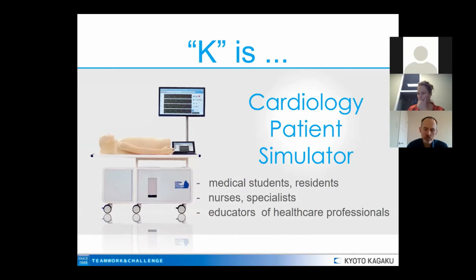education, which are dedicated to research about finding new teaching ways. They also use this model to make their papers, their research. So this is a model widely used in many areas.